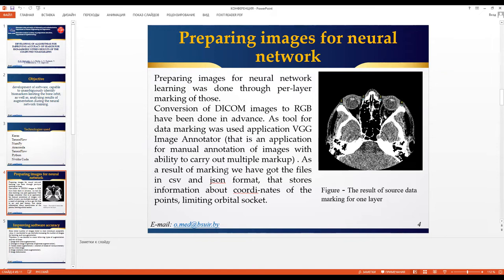The VGG Image Annotator is a very simple open source tool with no major problems. It is an application for manual annotation of images with the ability to carry out multiple markup. As a result of marking, we have data files in CSV or JSON format that store information about coordinates of the front points limiting the orbital socket.